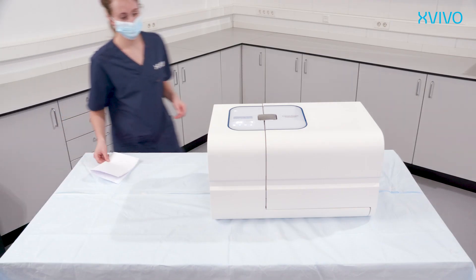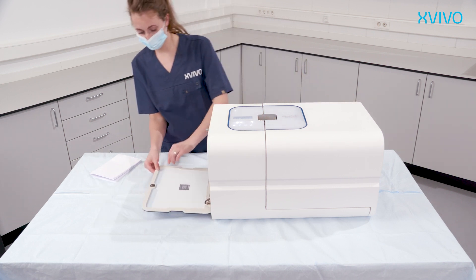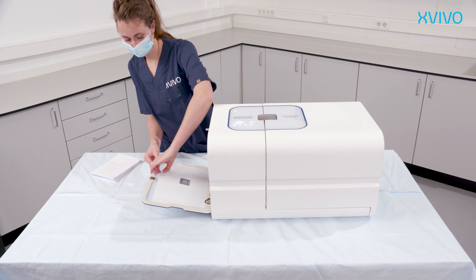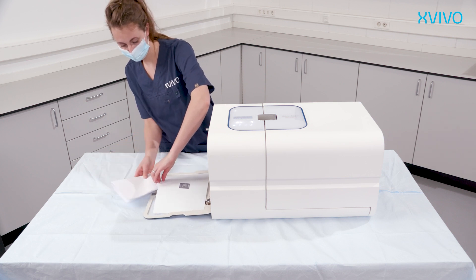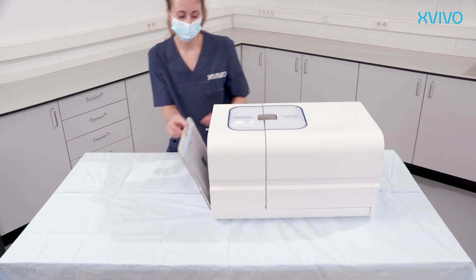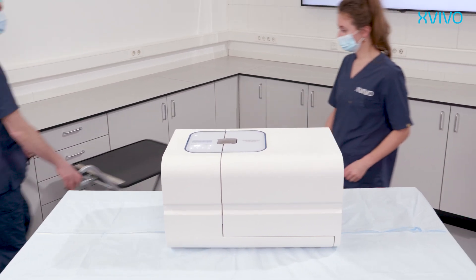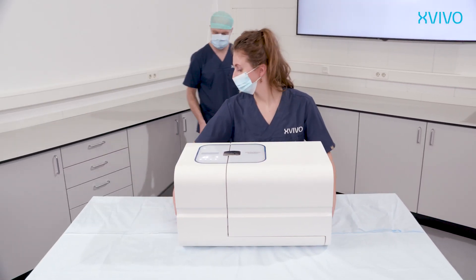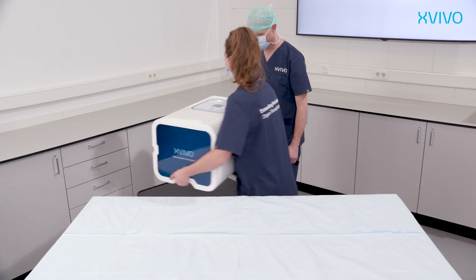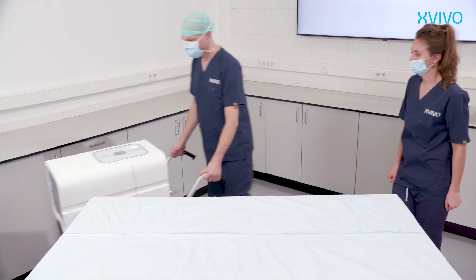Open the compartment door to insert organ identification documentation. Before transporting the Kidney Assist Transport, make sure there are four fully charged batteries in the system and the lock on the cover is closed. Lift the device by grabbing the incorporated carrying handles at the bottom of the device. Place the device on a hard, horizontal, and stable surface during transport, for example, the trunk of a car. Avoid blocking of the oxygen vents at the bottom of the Kidney Assist Transport.